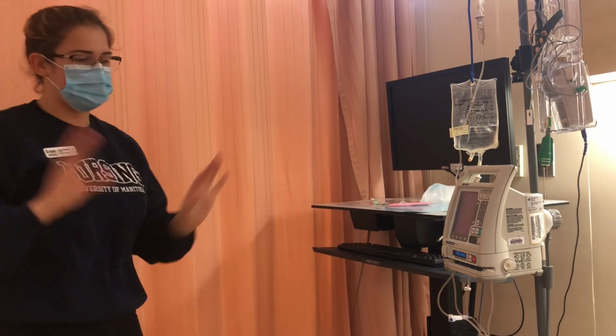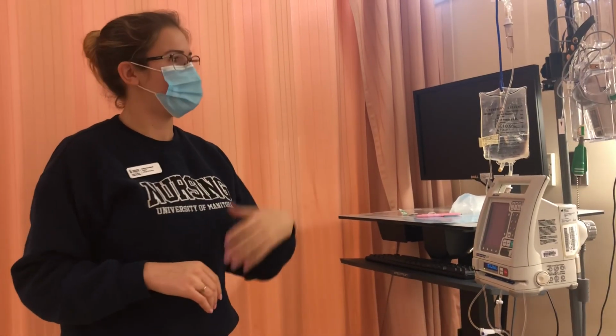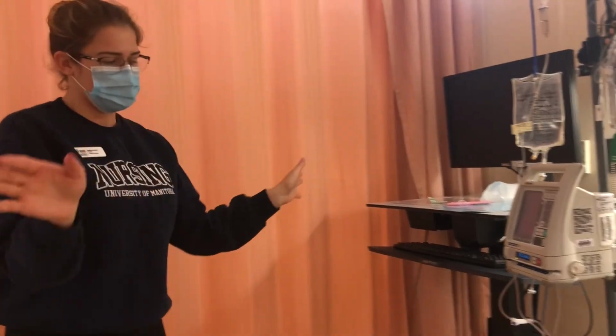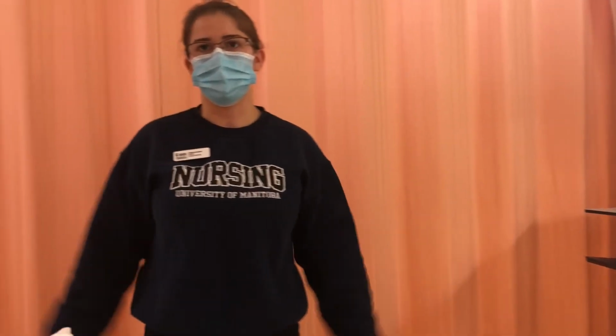So as I'm exiting the room, I'm going to do my exit safety check. I'm going to be telling the patient I'm going to be returning to check on them, and I'm going to infuse a 15 cc flush in 1 hour once the drug has been administered. So I'm leaving, making sure the call bell's in reach, the patient's not in any distress, the rest of my exit safety check, and that's my demo.